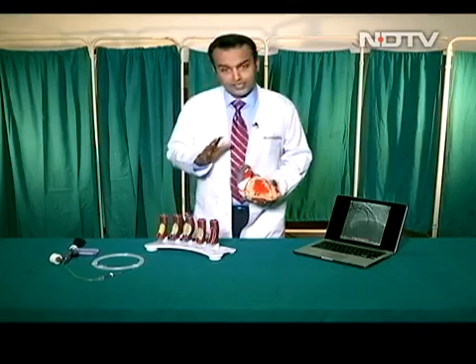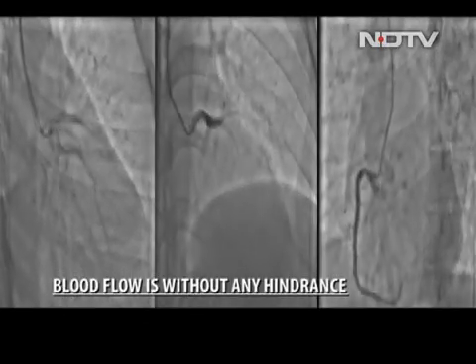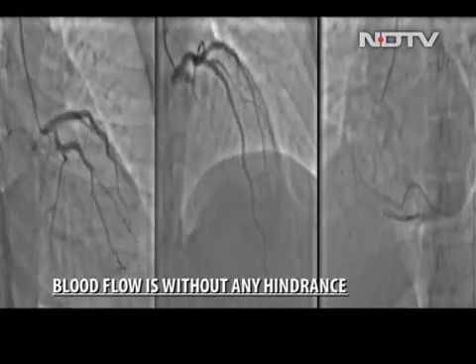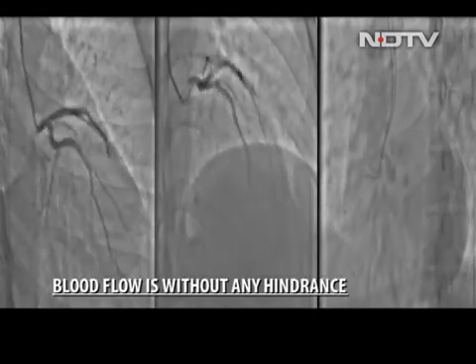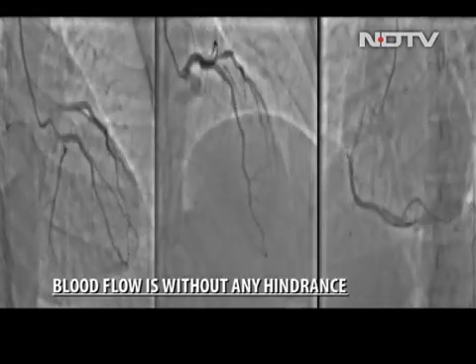Normally, your vessels are nice and smooth. Now, this is an example of a normal coronary angiogram. You can see how nice and smooth the vessels are, how the blood is flowing smoothly and uniformly.